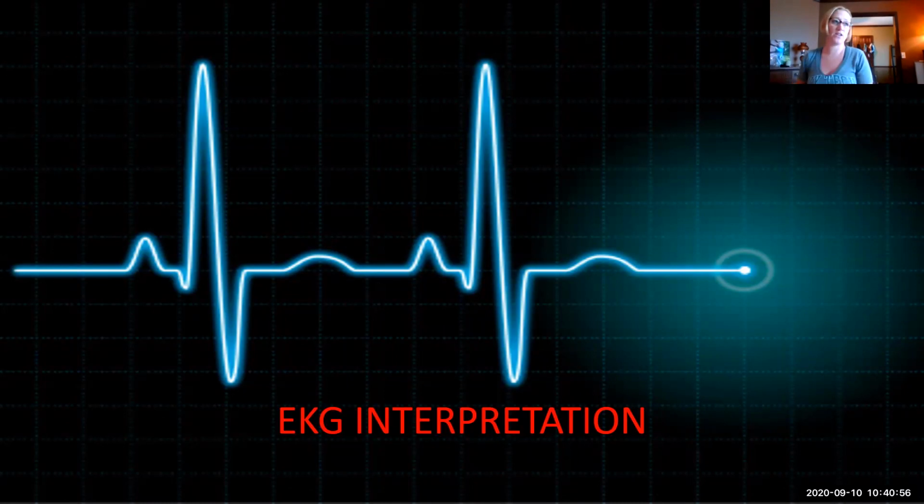If it is accurate, then you're going to assess your patient as to whether they're stable or unstable. Are they starting to have symptoms as a result of this dysrhythmia? Are they tachycardic with hypotension? Are they becoming diaphoretic, loss of consciousness, those type of things? So you always want to assess your patient and treat the patient, not just the monitor.